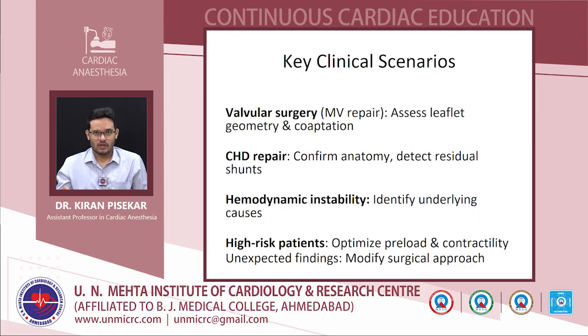So these are the key scenarios where we can apply TEE in valvular cases for the assessment of the leaflet geometry and coaptation. In congenital heart disease, confirm the anatomy first and then detect the residual shunts in the post-operative period. And in hemodynamic instability, as I discussed earlier, and in high-risk patients, to optimize the myocardial contractility, and if there are any unexpected findings which can modify the surgical approach.